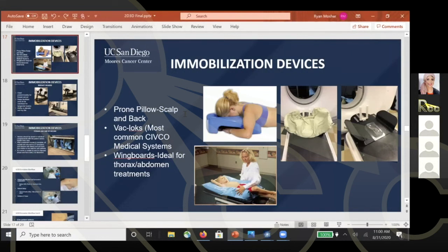So what we have again, they asked about the pediatric. Of course, pediatric simulation has another issue regarding they are small in everything. They have special masks, special fixation tools. We cannot use the adult fixation tool for kids. Am I right? Actually, take for instance our head and neck masks. They're kind of one size fits all, so you can use them for children as well.